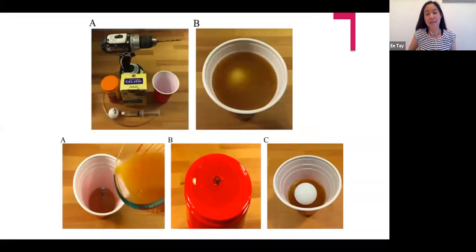So I thought this was also very creative. What these people tried to do, can anybody guess? Can you think of it before I tell you? So they're trying to do an optic ultrasound with a ping pong ball.